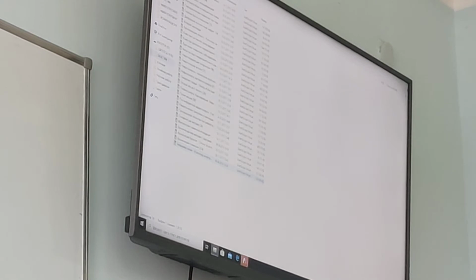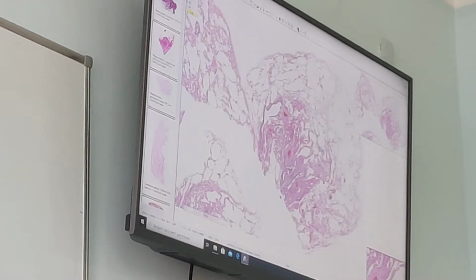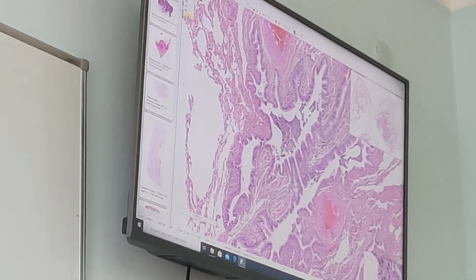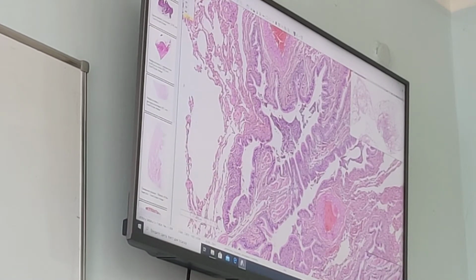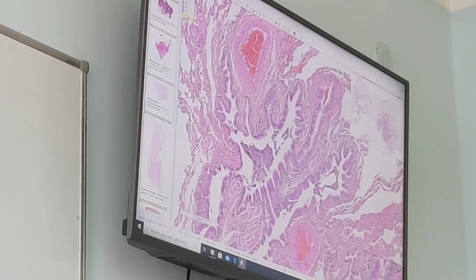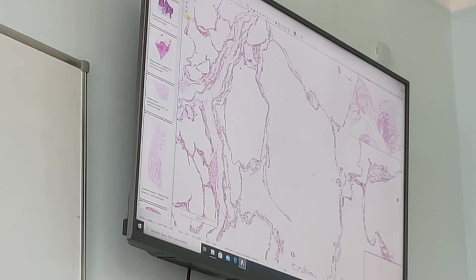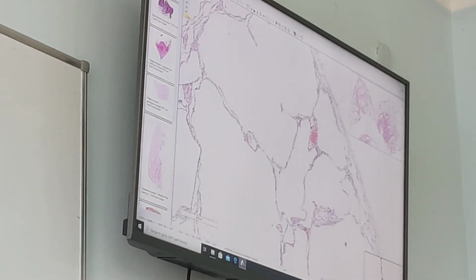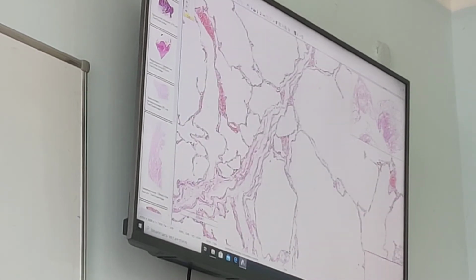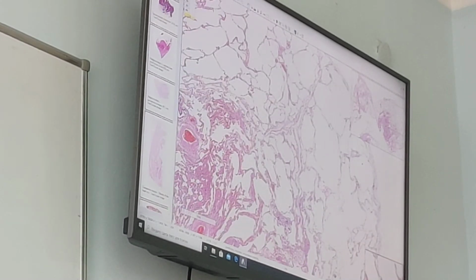In continuation of it, emphysema of the lungs. Emphysema of the lungs, also we can see bronchi. In the lumen of bronchi, some remains of inflammatory cells. In the peribronchial space, connective tissue growth, sclerosis. So the possible reason for emphysema was chronic bronchitis, without changes in alveoli: distension, thinning of the walls, rupture of the walls, leading to bullae formation. Compare sizes. Yes, normal alveoli with emphysematous changed alveoli. This is emphysema of the lungs.